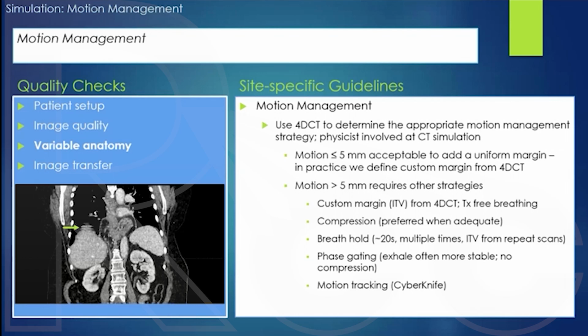To manage the difference between the CT and MR, primarily you will look at the area you are interested in. Number one is the target area. If you use the MRI or PET to facilitate the target contour, the first thing you will look at is your alignment in the target area. Despite the positioning being different, if you can get good registration in the area you are interested in, it's still usable.